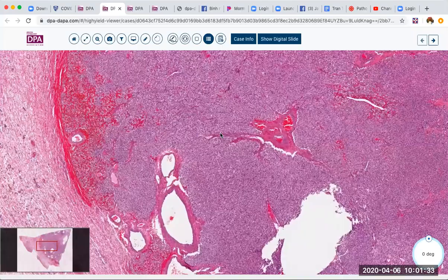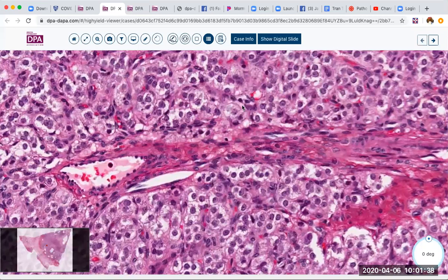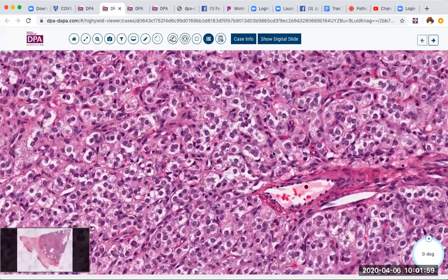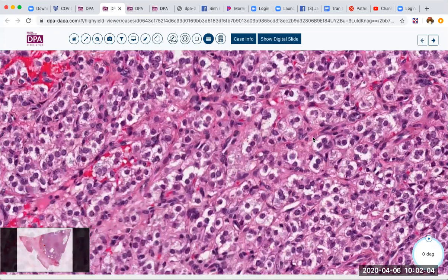On higher magnification, we can see that these tumor cells have fairly uniform round nuclei, small nucleoli, and slightly lacy cytoplasm. We notice the high vascularity in between tumor cells. We don't see any particular high-grade anaplasia to the cells, and we don't see areas of mitotic activity. If we scan around, we can look for quite a while and not find mitoses in this tumor.